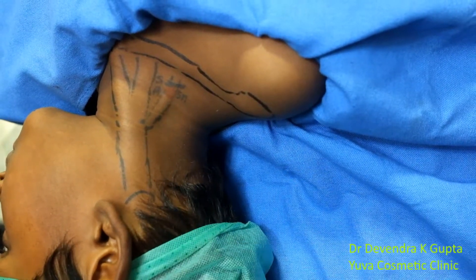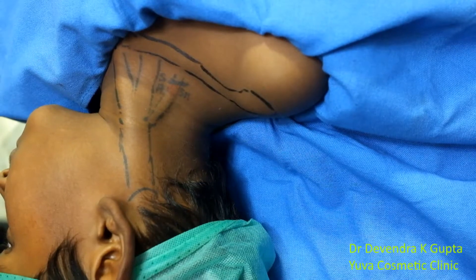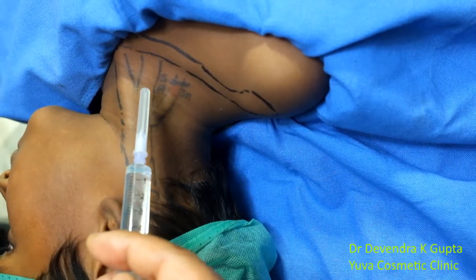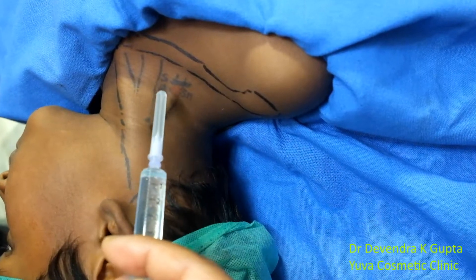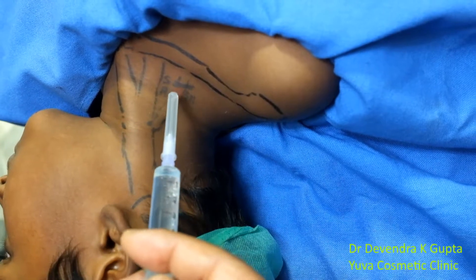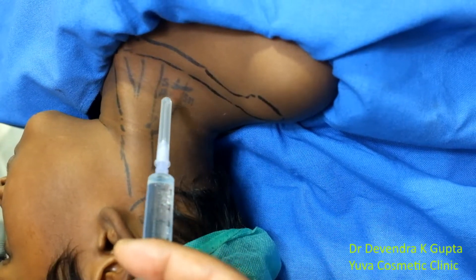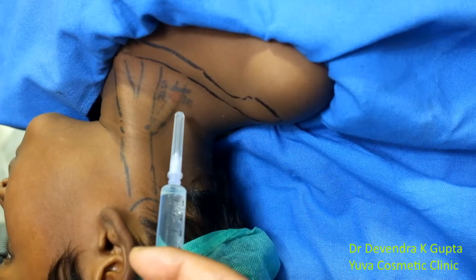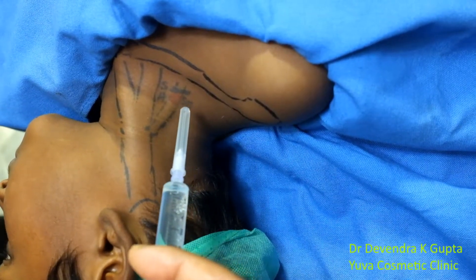Now, an important thing: move the finger from the sternocleidomastoid — the fingertip will dip and will be over the scalenus anticus. Then you will feel a cleft, that is the inter-scaleni cleft. And by the side you can feel the scalenus medius muscle.